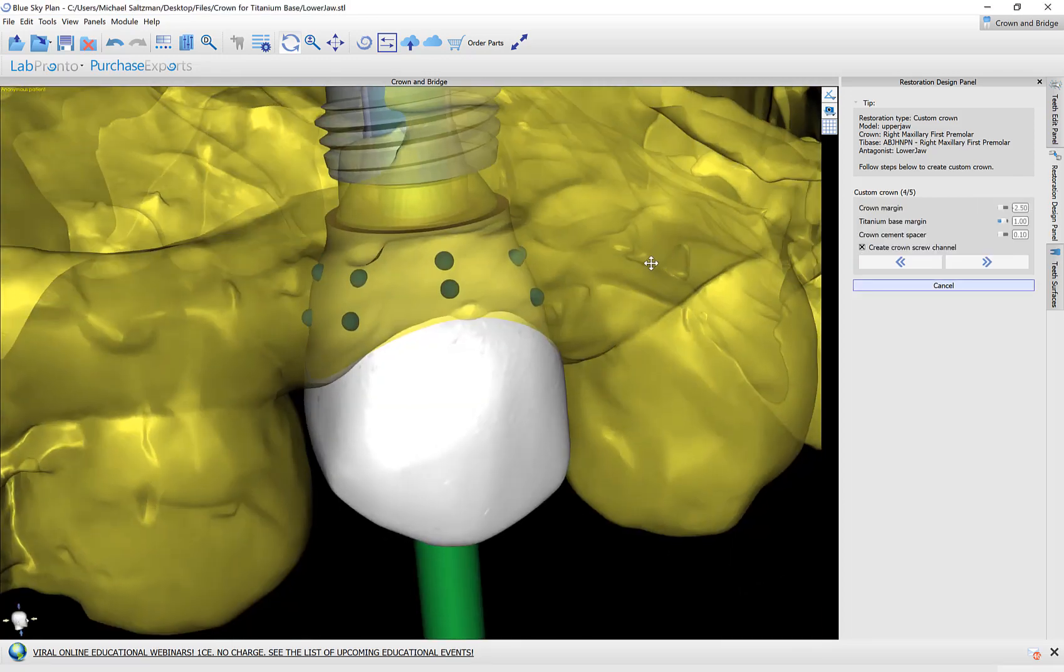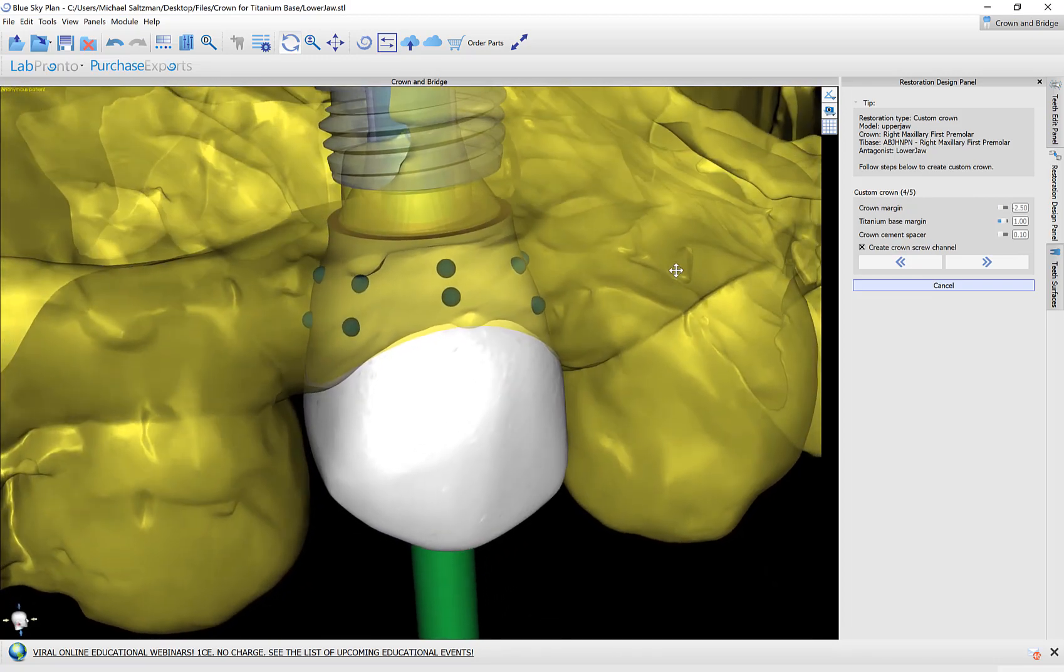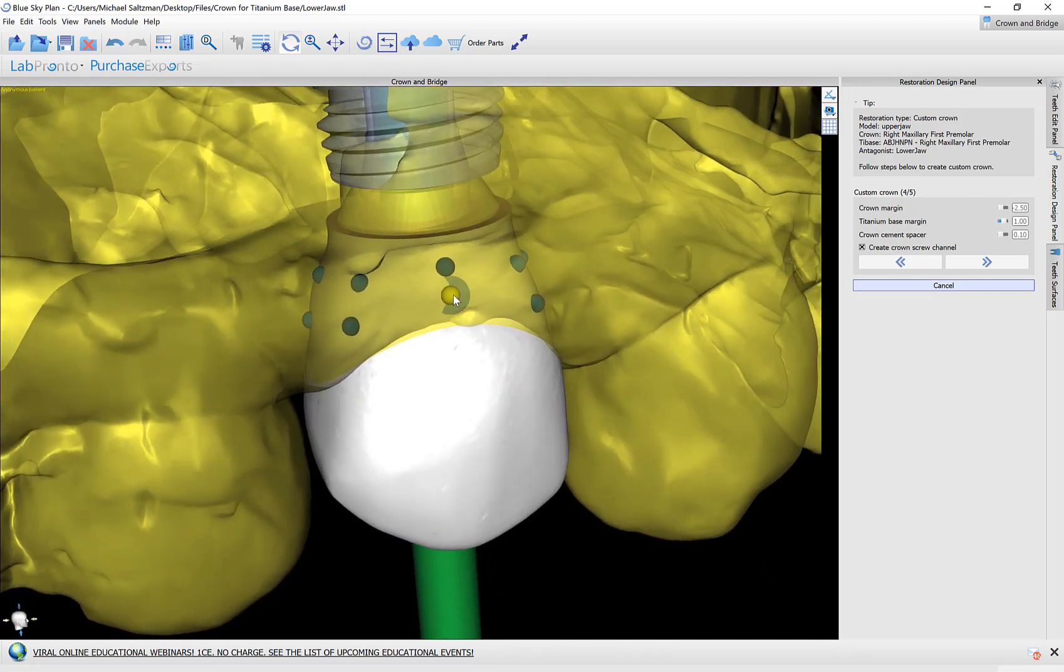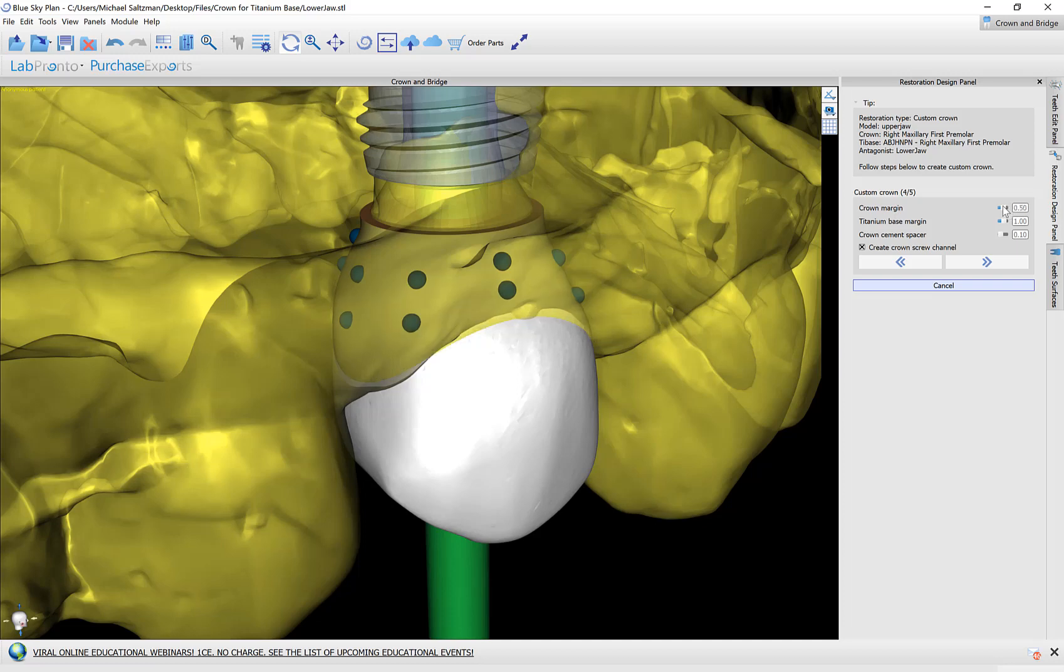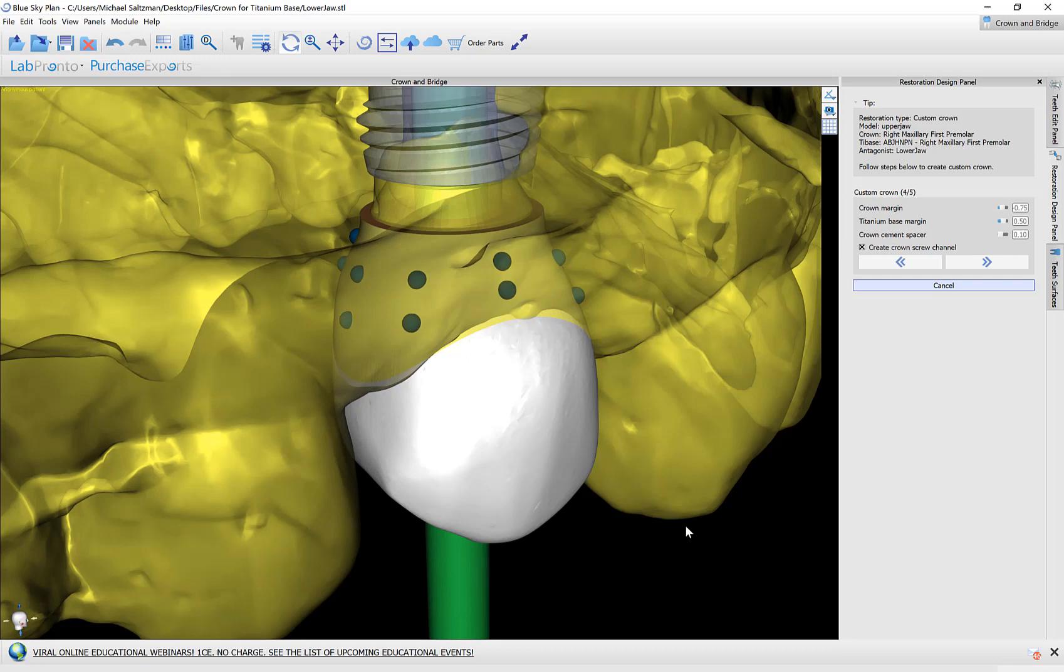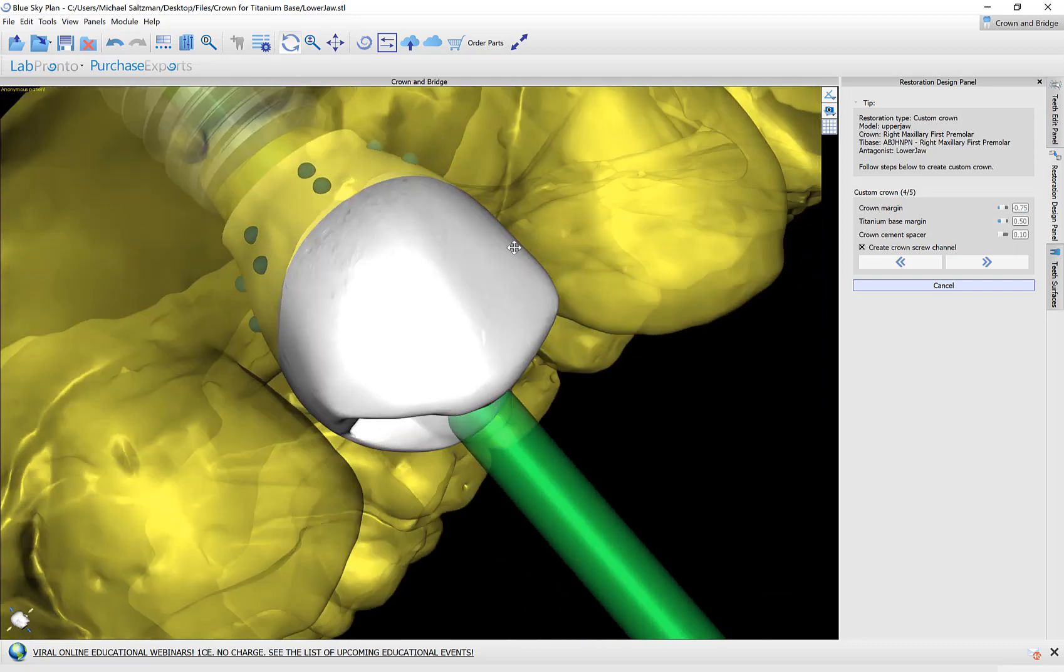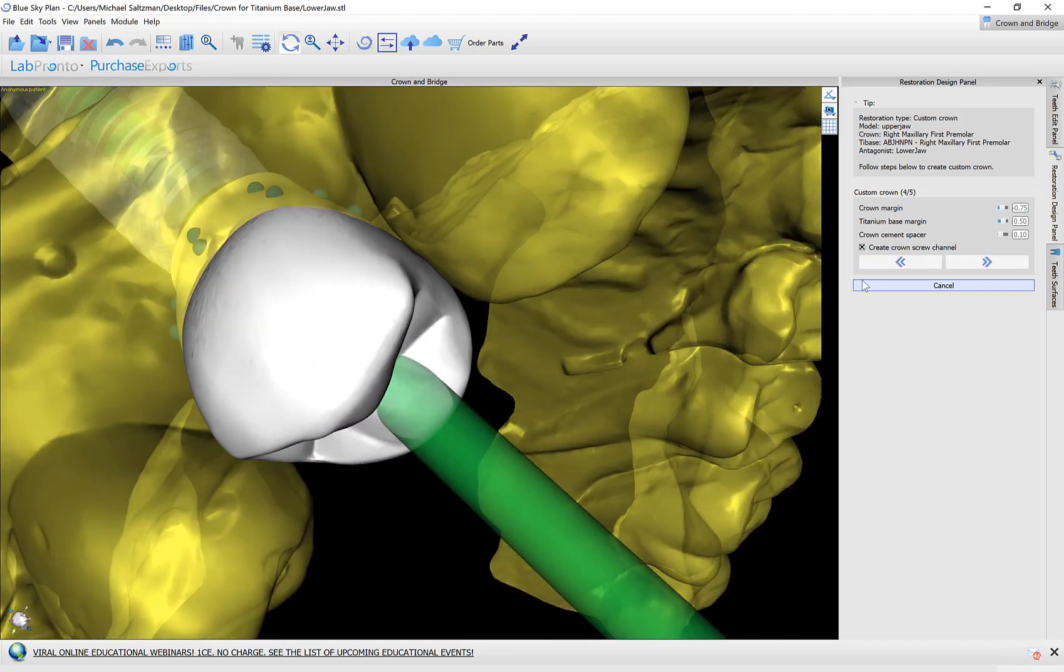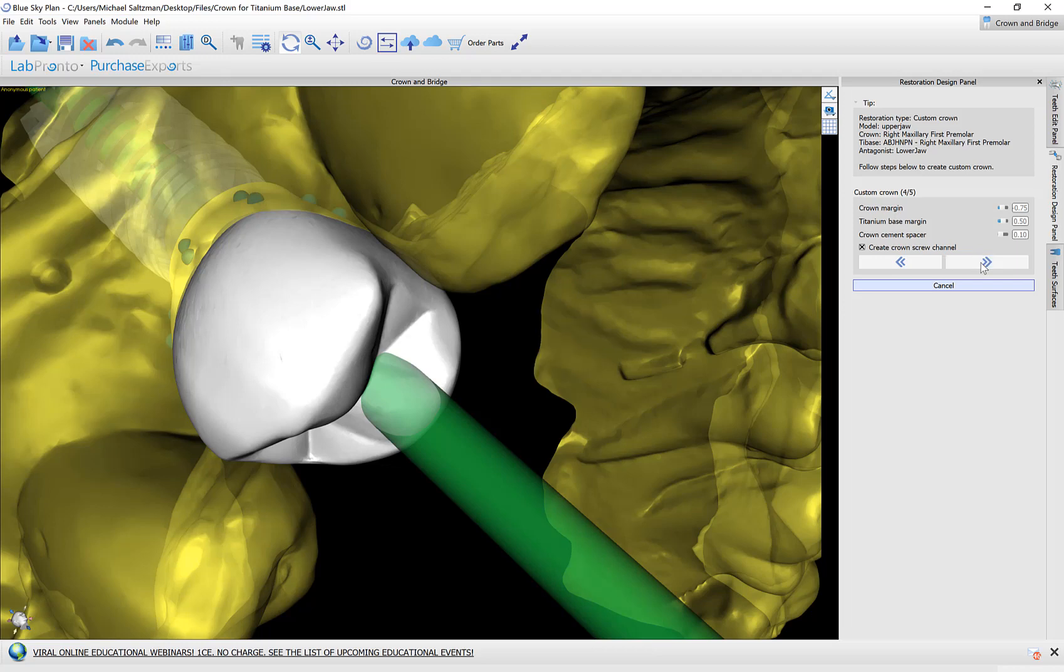In this step we could edit how the crown connects to the titanium base abutment. Just use your left mouse button to grab and drag any of the nodes to edit that connection. We have the sliders here for the crown margin. We can see that as we change and move the slider how that affects the margin of the crown. Titanium base margin does something similar to how the crown will connect to the titanium base abutment. And the crown cement spacer which is the space between the titanium abutment and the crown for the adhesive. We have the option of creating a screw channel which is toggled on and marked by default. And then I'm going to click next.